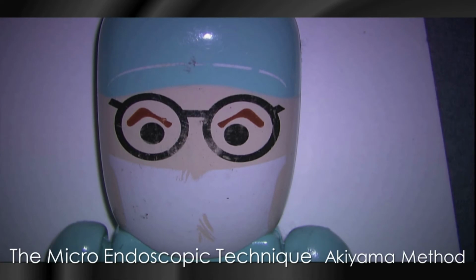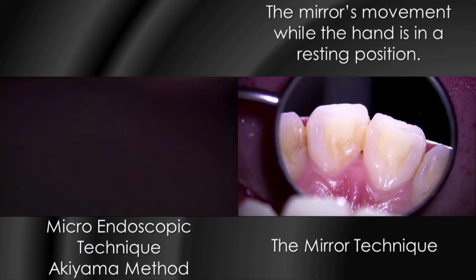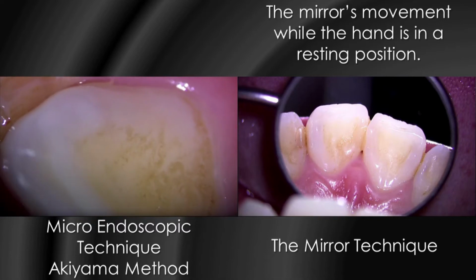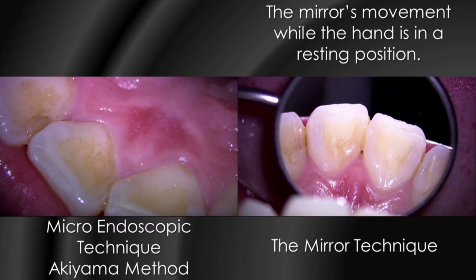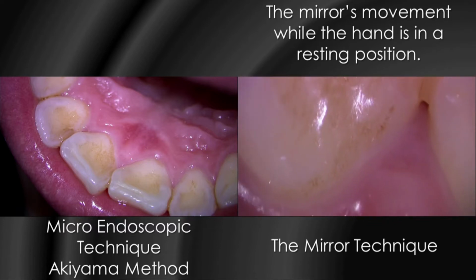This is the microendoscopic technique. So the left side is the microendoscopic technique. The right side is the mirror technique. The mirror's movement while the hand is in a resting position. Here, it vibrates a lot.